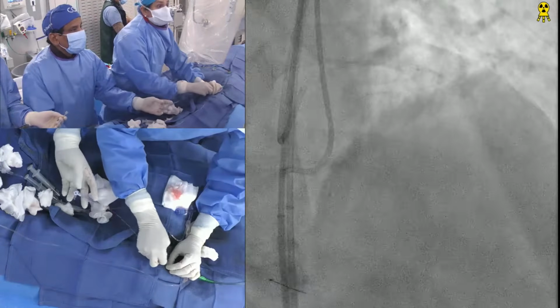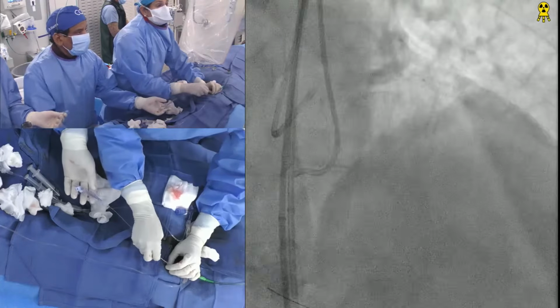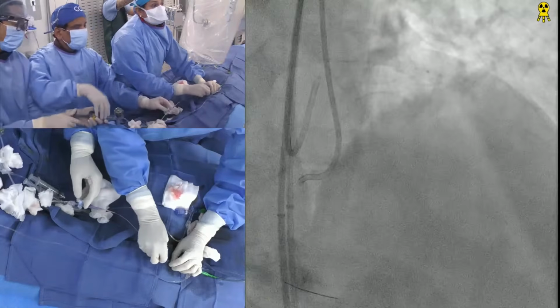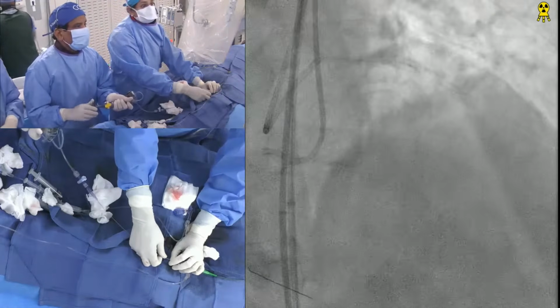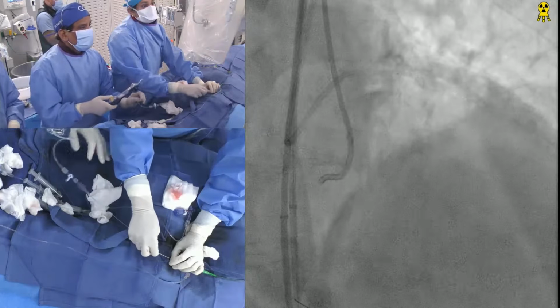Okay. Problem, right? Should we just go with a little balloon here? Okay, try. It's not going to do that. Wait one second. Okay, I'm going up. I think we are not there. Yeah, that's okay. That's fine. It changes things, morphology. Go again.